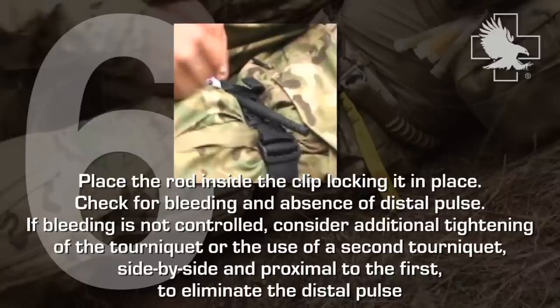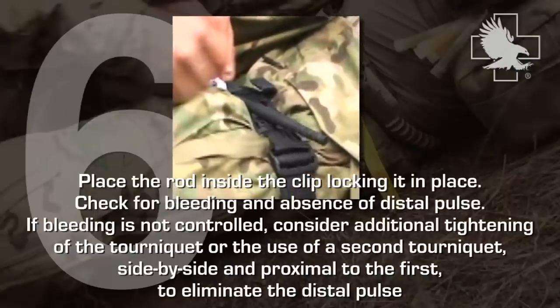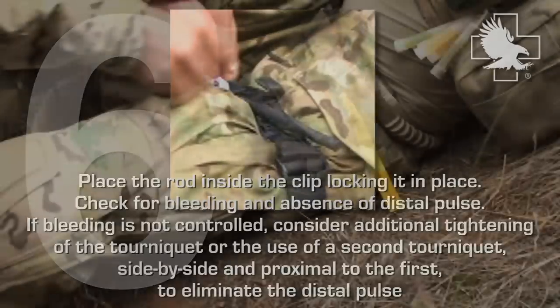If bleeding is not controlled, consider additional tightening of the tourniquet or the use of a second tourniquet, side by side and proximal to the first, to eliminate the distal pulse.